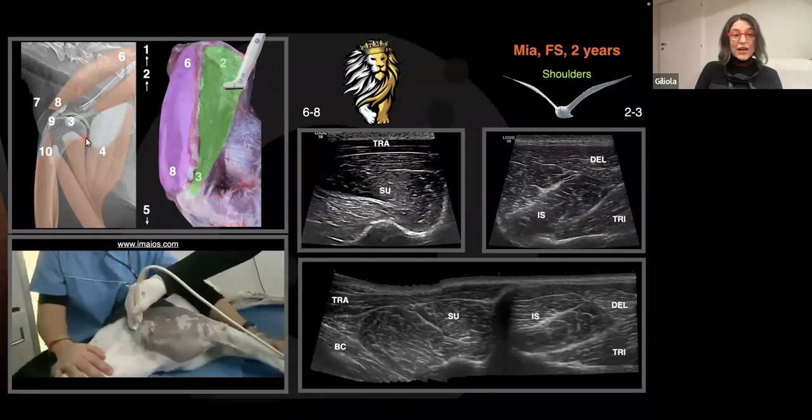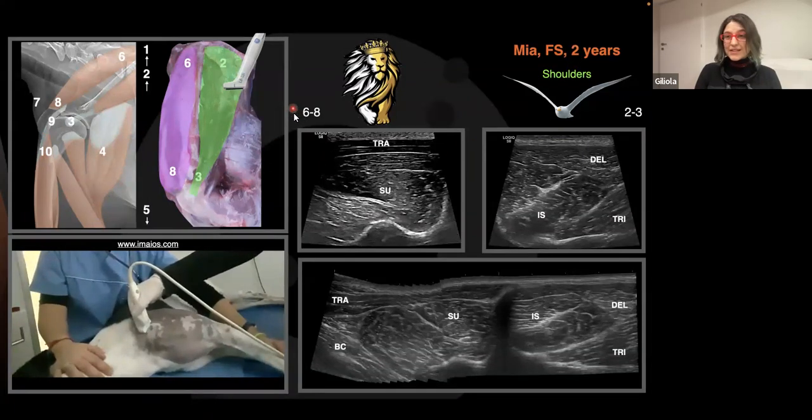So if you're looking at a radiograph, you should also consider the important muscles when we are considering the shoulder. There will be the infraspinatus, the green one, the supraspinatus, the bicep tendon, and the triceps. These are probably the 4 most important muscles in the shoulder and the ones that most of the time create pain. These are static images.